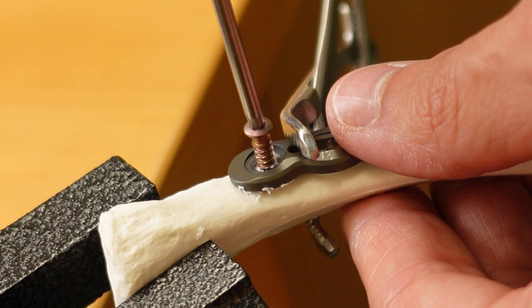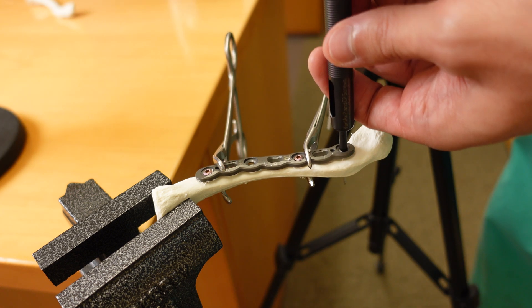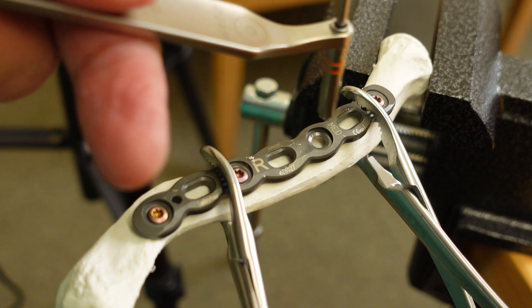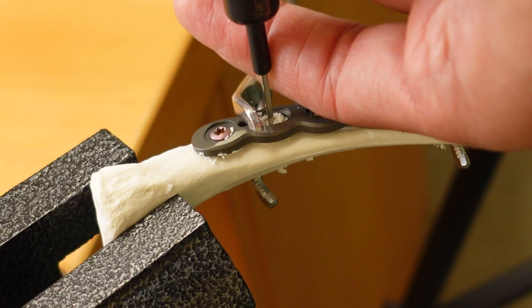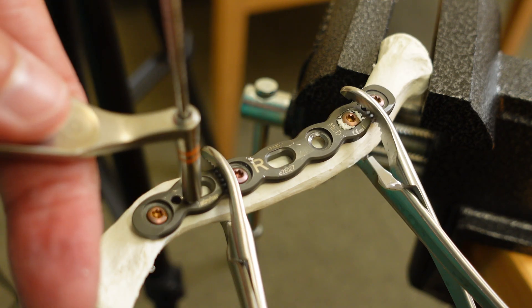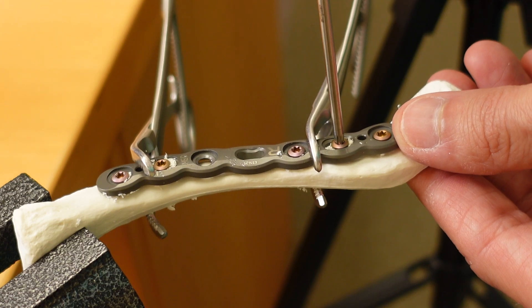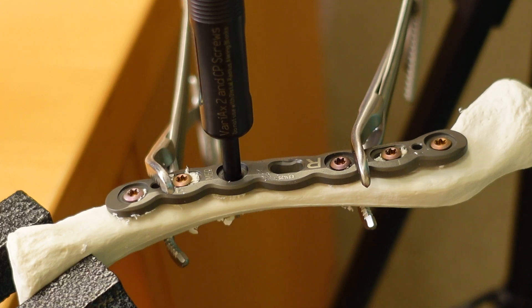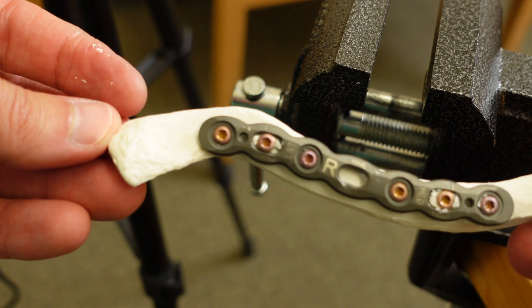We work to fill each additional hole with a screw — drilling, measuring, and then selecting and placing the appropriate screw, working our way along the plate and along the fracture, placing each additional screw. Finally, we are able to place approximately three screws on either side of the fracture site. Coming to the last screw, we drill, measure, and place the last screw, and the repair is complete.